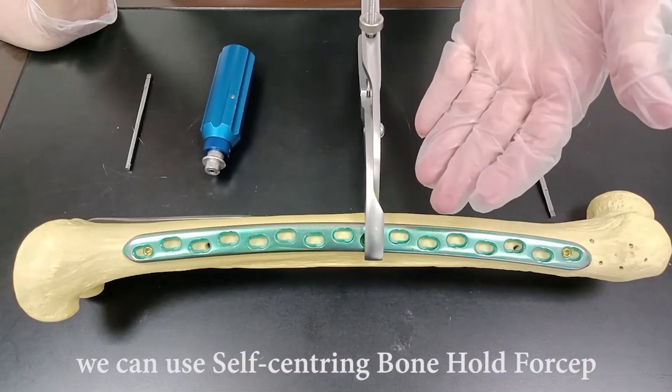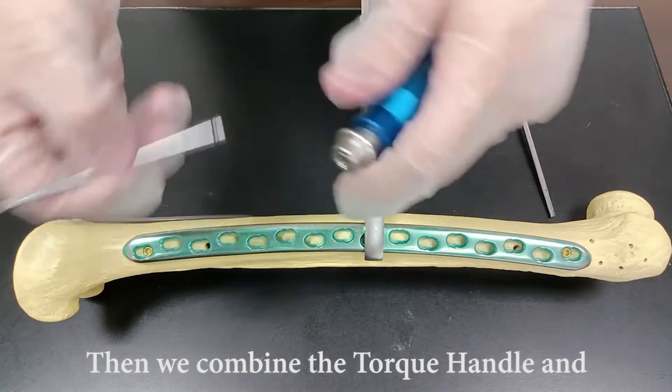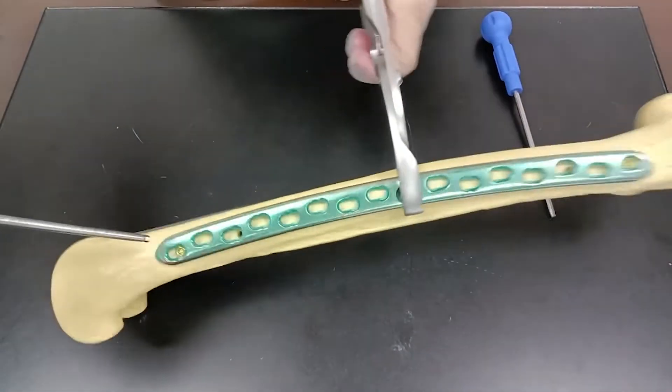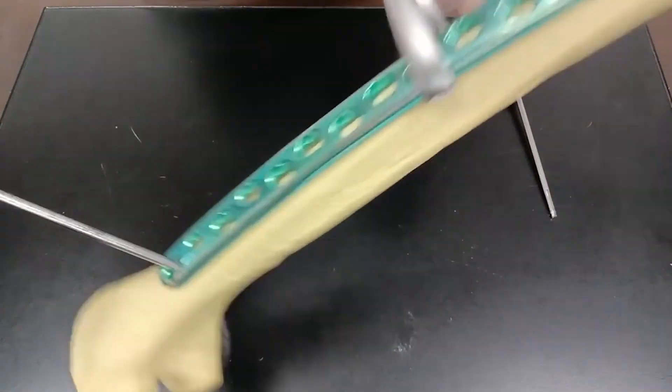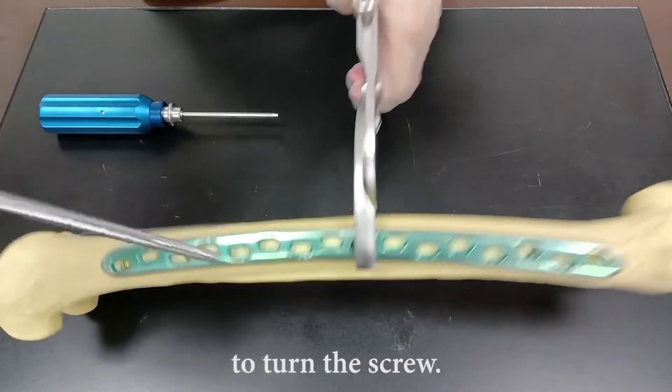We can use the self-centering bone hold forcep to keep the plate and the bone in place. Then we combine the torque handle and quick coupling screwdriver to turn the screw. Also, we can use the self-holding screwdriver to turn the screw.